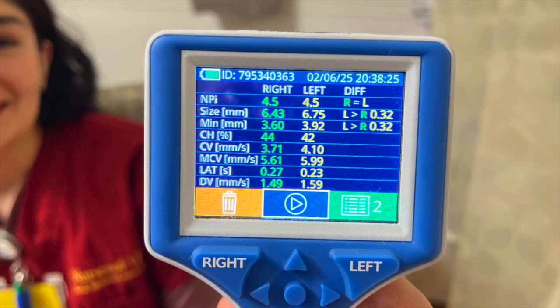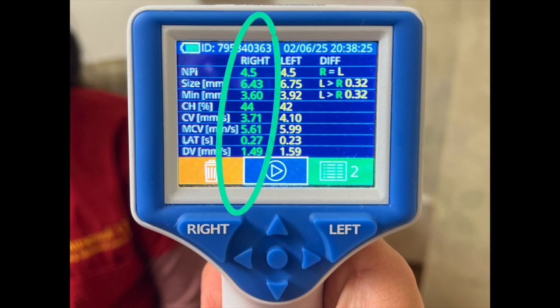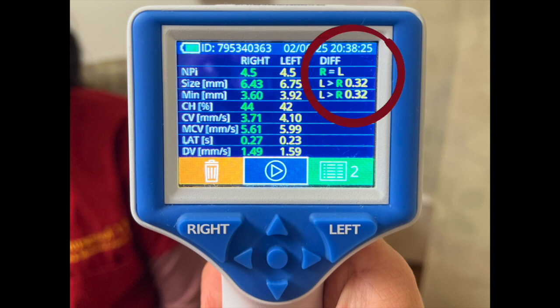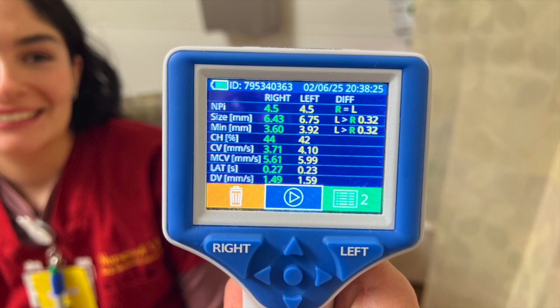When the bilateral pupil exam is complete, results will be displayed in green for the right eye and yellow for the left eye. This displays NPI and size along with bilateral differences in these measurements. Finally, remove the patient smart guard and leave it at the bedside.